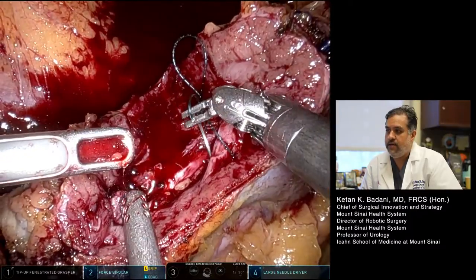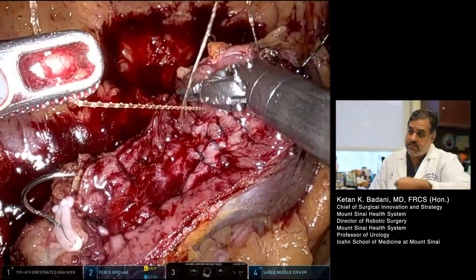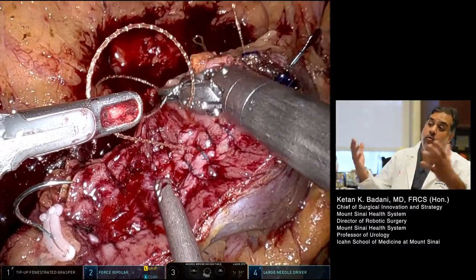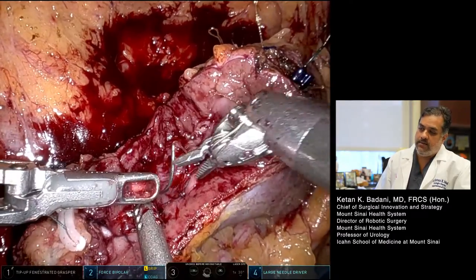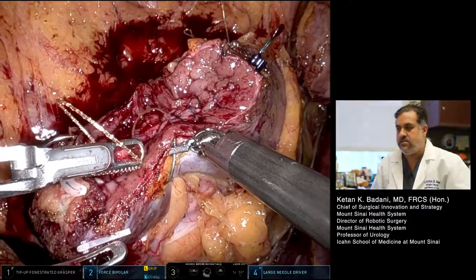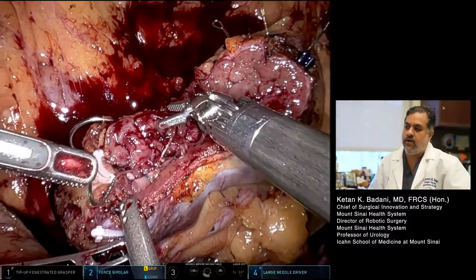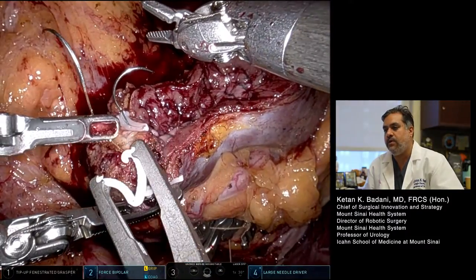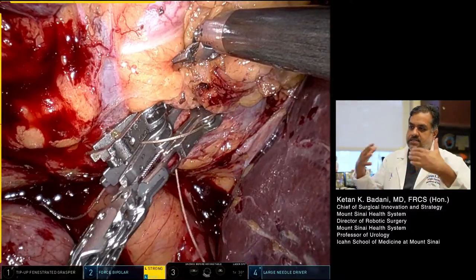I'm closing that collecting system — here's another collecting system entry. As I'm running from upper right to lower left I want to specifically close that with my running sutures. Depending on the size of the defect — and because this is a very endophytic tumor you're going to have a wider defect — it may take two or three lines of suture to completely cover the surface area of the kidney. I'm going to show you early unclamping and why that's valuable. Ultimately the ischemia time, even in very big defects, is usually very reasonable. Our clamp time at the 95th percentile ranges from six to twelve minutes. Some cases approach 18–19 minutes, but by and large, regardless of tumor complexity, it stays in that small range because of standardization and early unclamping.